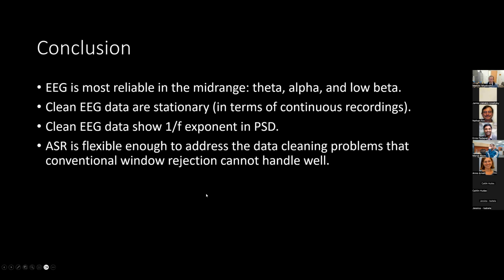And finally, ASR, this kind of complicated signal processing, may be intimidating because it could look like a complete black box, but you don't need to understand every mechanism of those black boxes. For example, you can use a smartphone although you don't know how it works, right? So what we need to do is understand the input-output relation. And we also have a control: where those knobs are to tweak. If you find overcorrection, how can you reduce the amount of correction? Or if you see undercorrection, you want to increase the correction power. As long as you have those controls over your data, I think that's fine.